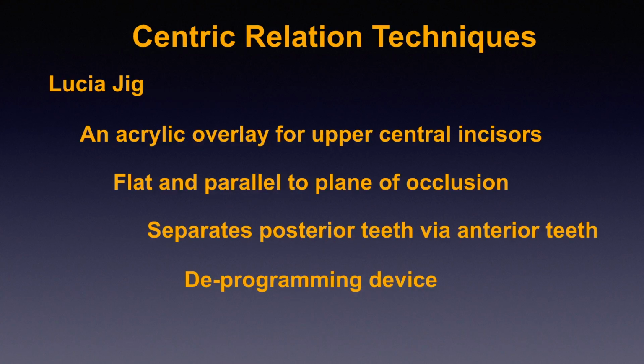It is an acrylic overlay which covers the upper central incisor teeth and provides a flat platform lingually for the contact of the lower central incisor teeth. The platform is ideally parallel to the plane of occlusion. It separates the posterior teeth by contact between anterior teeth and is a deprogramming device.